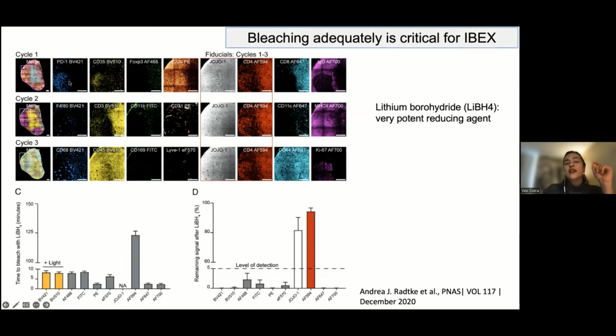It is good that in each cycle, if you're using the same fluorochrome, you use molecules that are not concurrent in the same cell. They can be seen in different cells, because even though you're going to look in a microscope and see if you bleached it well, you'll be sure that you're not going to have overlapping in the same cell type. So this is one important thing. Bleaching is absolutely critical for you having a good staining in each cycle that you do.